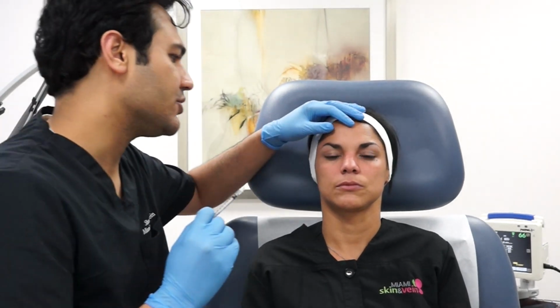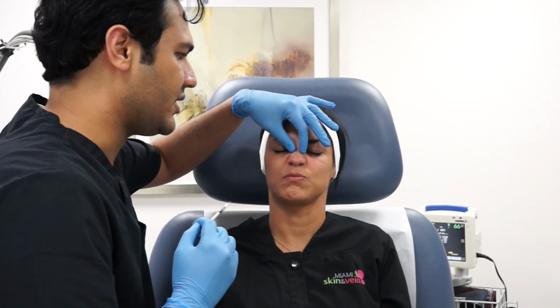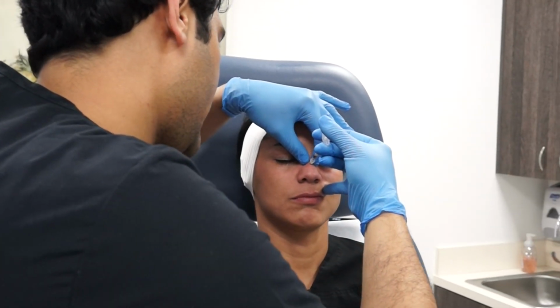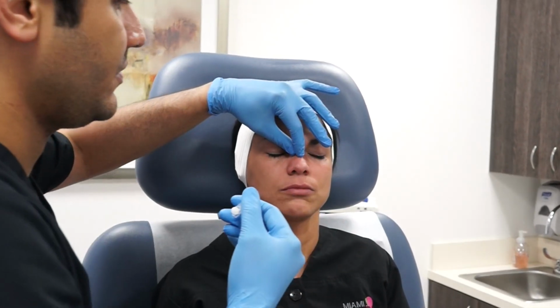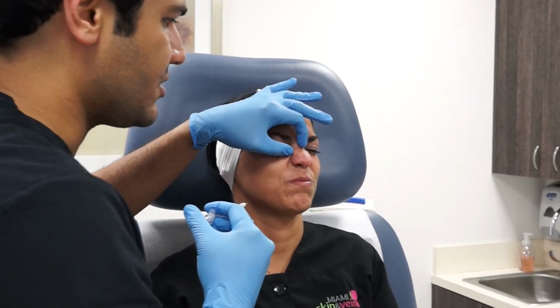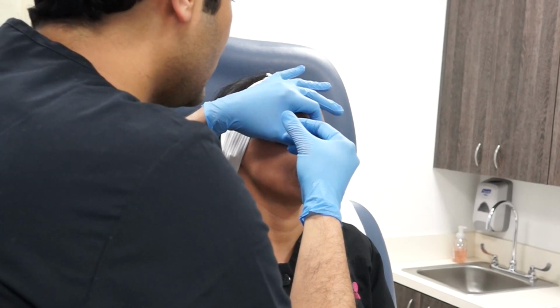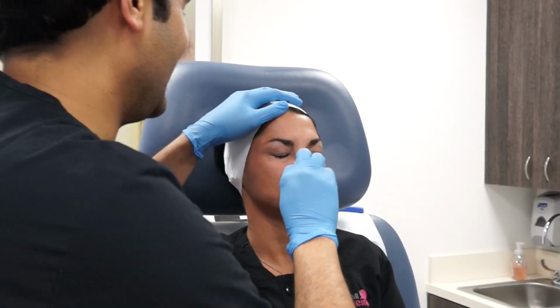So this is 4 units of Botox right here. I'm going to ask her to frown. And you can see that nasalis right there. And what I like to do, relax. Relax before injection. And right into the body of the muscle right here, 2 units. Great. And then I'm going to have her turn, frown again for me. So you just go right, relax. Have the body of the muscle right here. And right into the lines there. Perfect. Iris is not bleeding at all. She's a great patient.